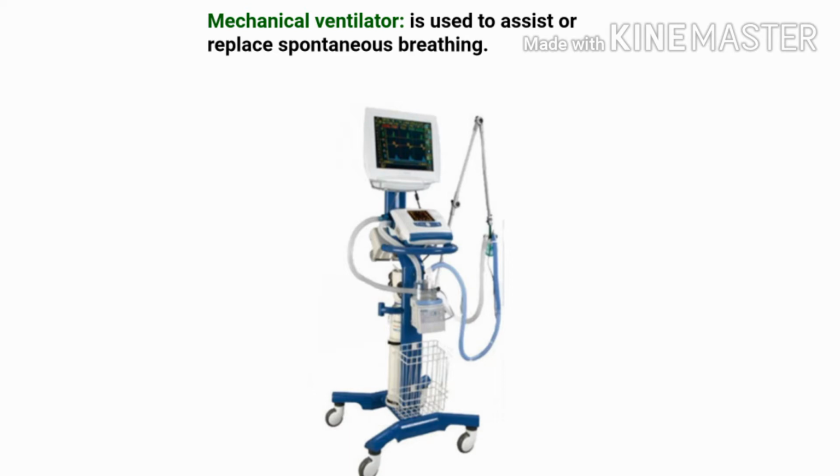So this is our first image. As you can see very clearly, this is the mechanical ventilator, and it is used to assist or replace spontaneous breathing.